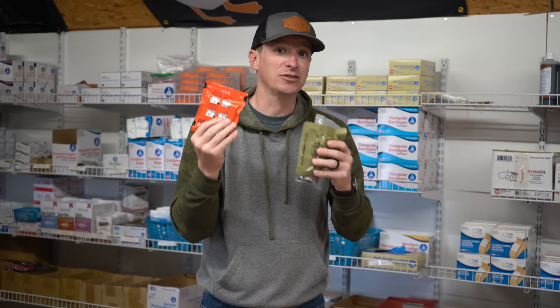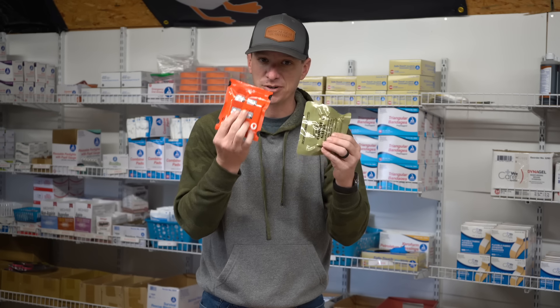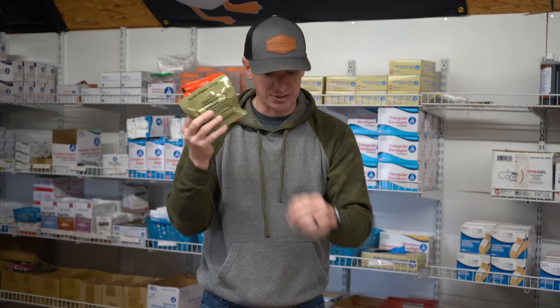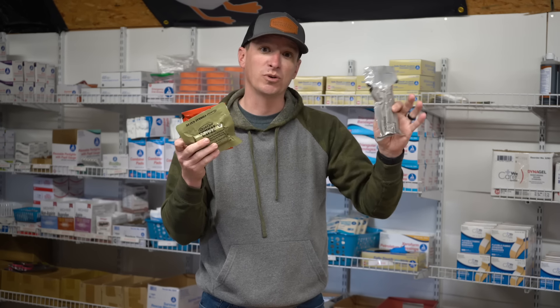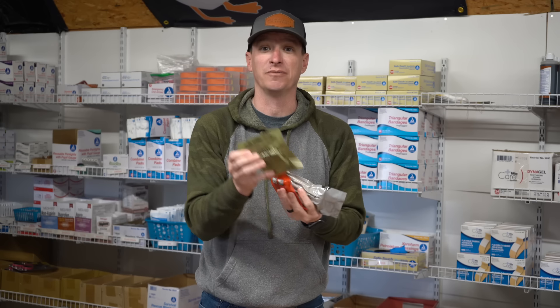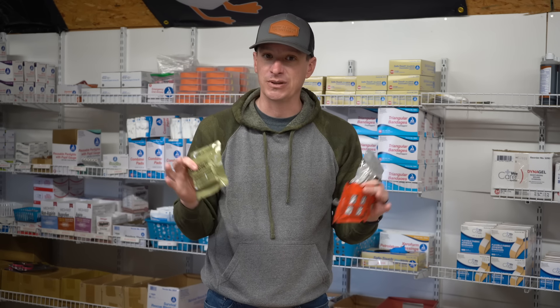Celox Rapid is also a choice here as a hemostatic agent. It just comes down to personal preference on which one you like better. Some people like combat gauze, some like Celox better, but Celox is more expensive. If you're on a budget, go with the $5 gauze. Combat gauze runs about $45, so if you start putting multiple packs in your kit, it's going to get expensive fast.